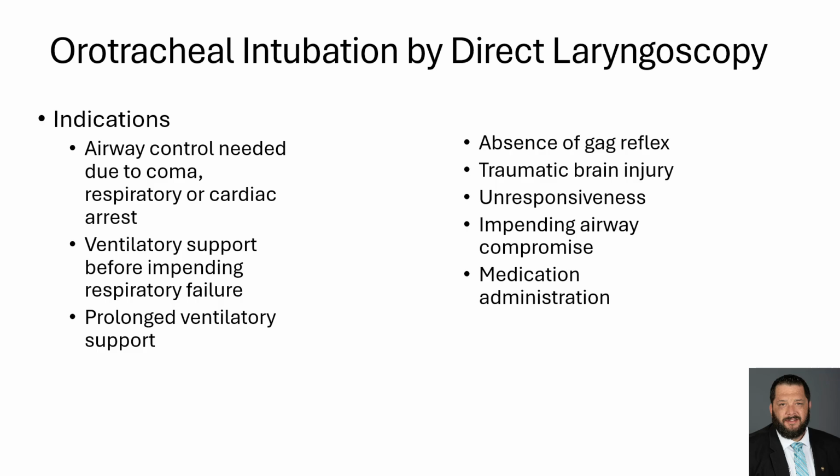Impending airway compromise or medication administration. I would argue that with today's EMS, medication administration should not be an indication alone for intubating a patient. We have other tools at our disposal, including administration of intramuscular, subcutaneous, or intraosseous medications.